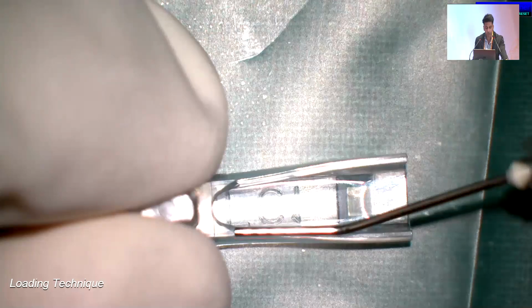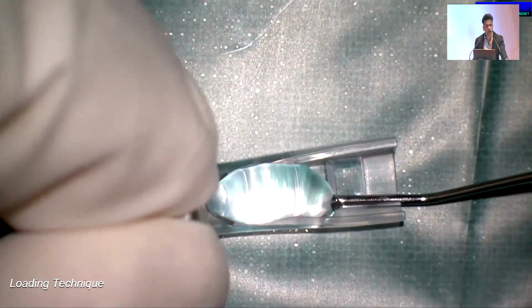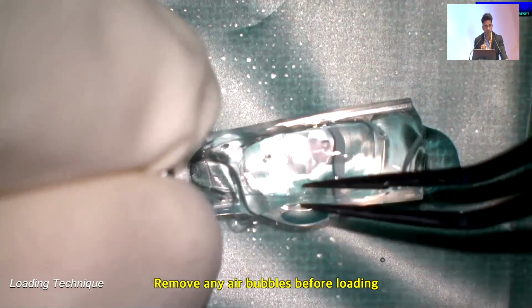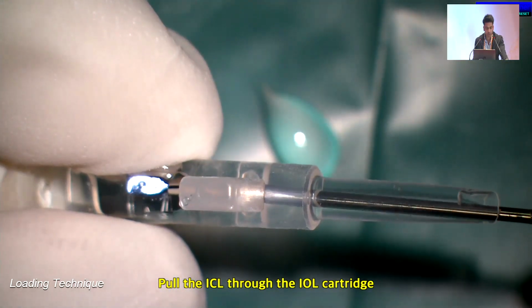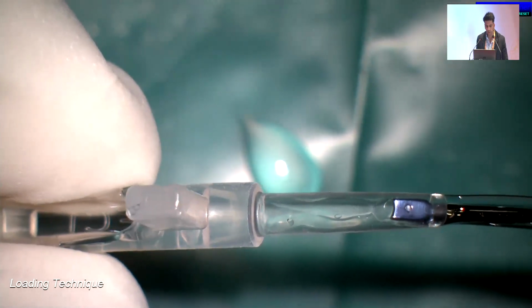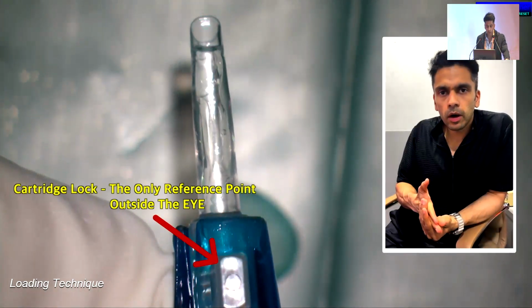When you're loading this lens, ensure that in the cartridge, you try not to have any bubbles. Air bubbles will prevent you from seeing the orientation holes of the lens, which I'll show you as we go along. Once the lens is loaded into the cartridge, we usually use the pull through mechanism. When you use the pull through mechanism, it fits in well into that cartridge.